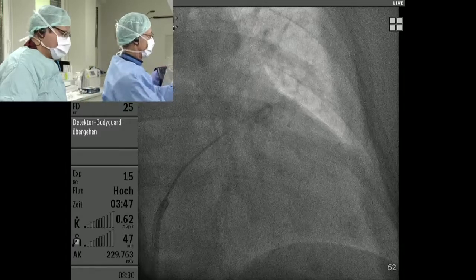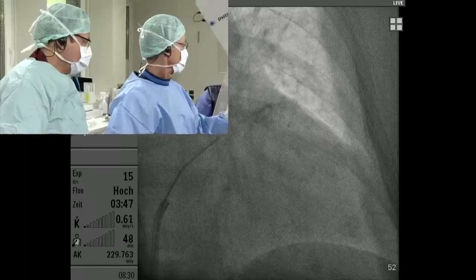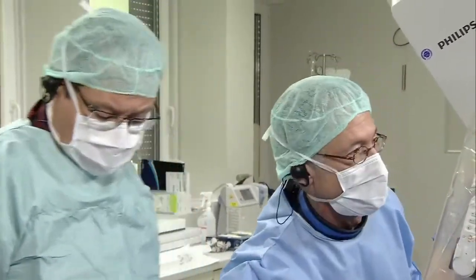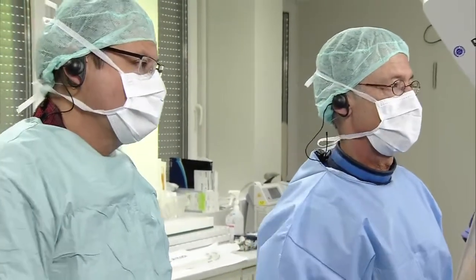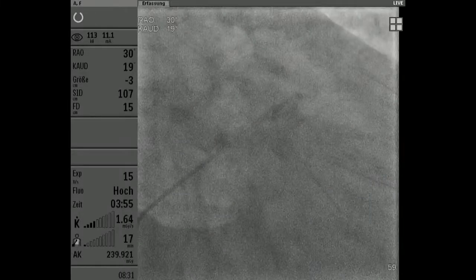Dr. Daniels, what do you do in Oxford? Do you have arterial access or not? For these elderly patients who we're going to give a GA to, we do tend to. You do? Okay. But there's no requirement to. Yeah, in the UK there isn't a requirement. All the PFOs and ASDs get GAs. The TAVIs sometimes get GA. We don't do arterial access routinely. Yeah, it's the American way.